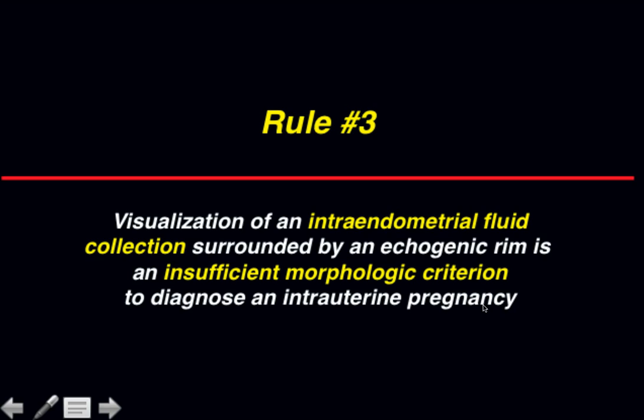So, rule number 3. Visualization of an intraendometrial fluid collection surrounded by an echogenic rim is an insufficient morphologic criterion to diagnose an intrauterine pregnancy.